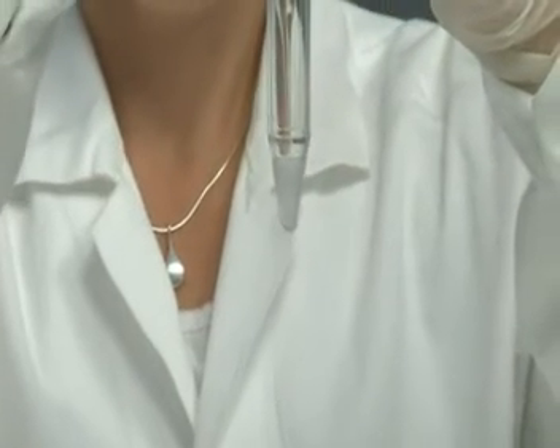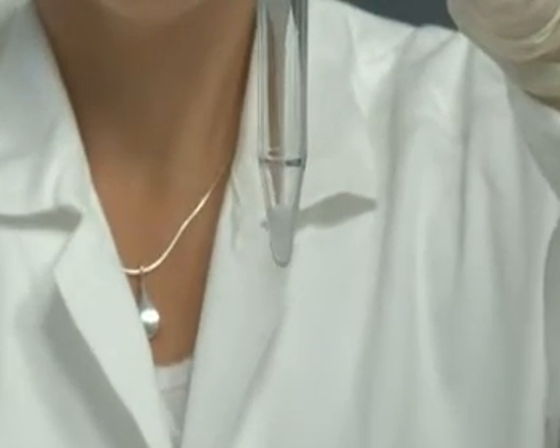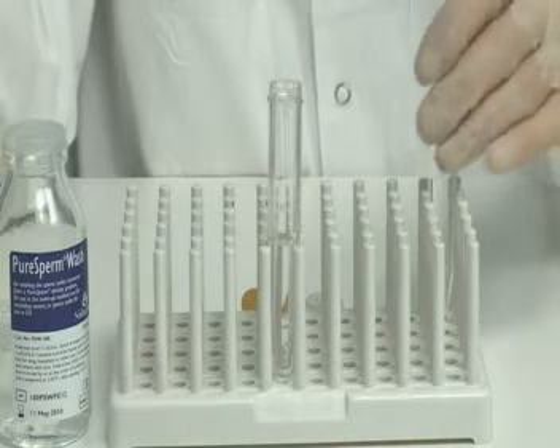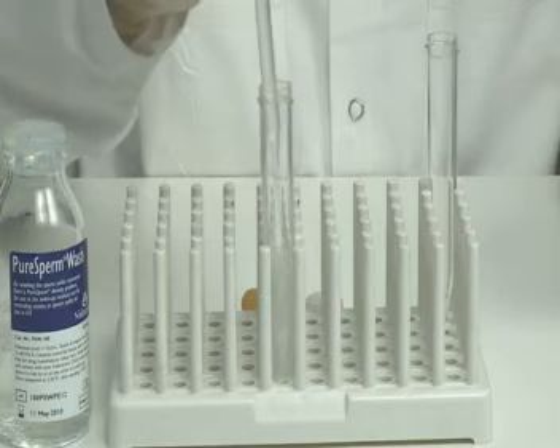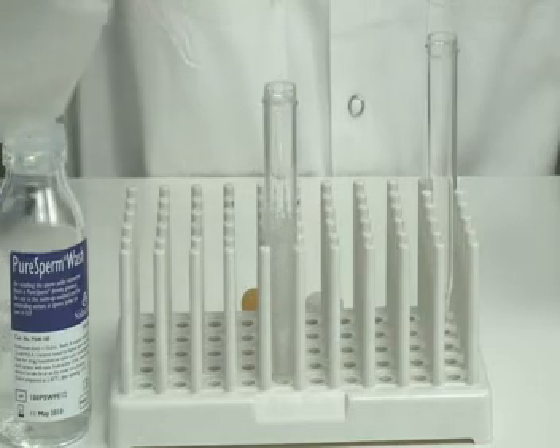Transfer the pellet to a new sterile conical centrifuge tube containing 5 milliliters of PureSperm Wash. Suspend the pelleted sperm in PureSperm Wash.